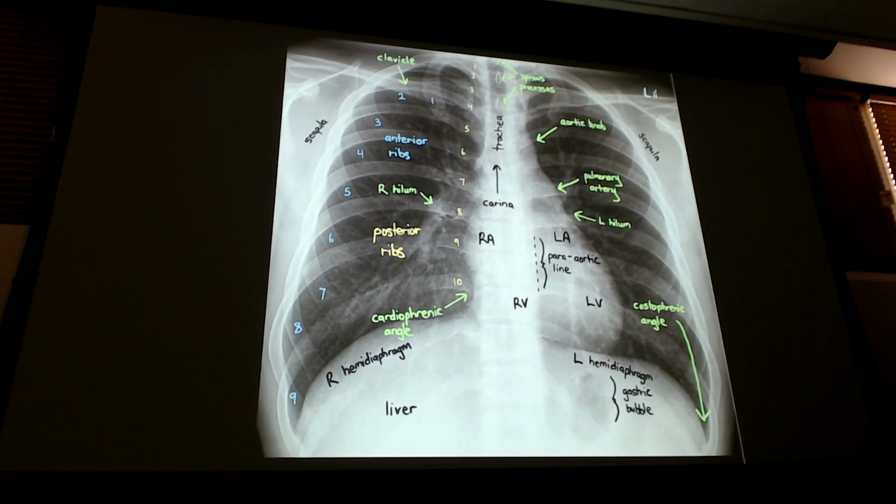Okay? When we get to the rib section, we'll explain why they look that way and how you can count them. Because that's important. Because one of the things we talked about was inspiration. It's not a good chest x-ray unless the patient has taken a big enough breath in to fill their lungs up as much as possible, because I'm trying to evaluate their lungs. And if I can't see all of their lungs, then it's worthless.